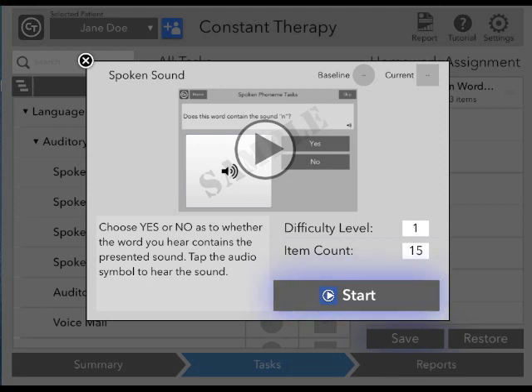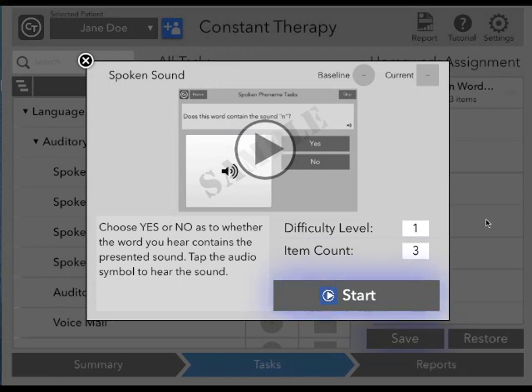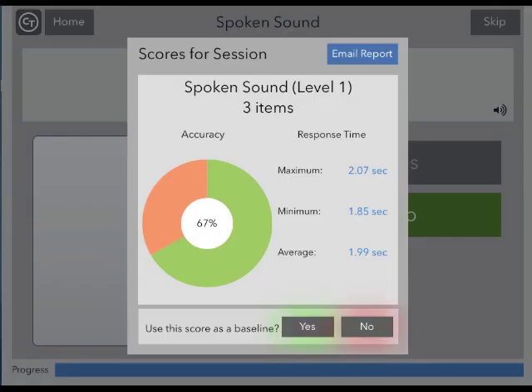Here we can also adjust the difficulty level and item count of the task. For instance, if we only want our patient to complete three items, we would tap on the number and enter the new item count. When the difficulty level and item count is set, the patient may tap Start to begin. When the patient has completed the task, you'll see a pop-up screen that explains how he or she performed. If you would like to use this performance as the patient's baseline, simply tap Yes. This will be recorded as the patient's baseline performance so that you can compare your patient's progress to this score later on.